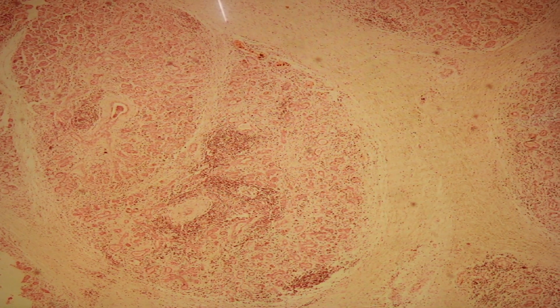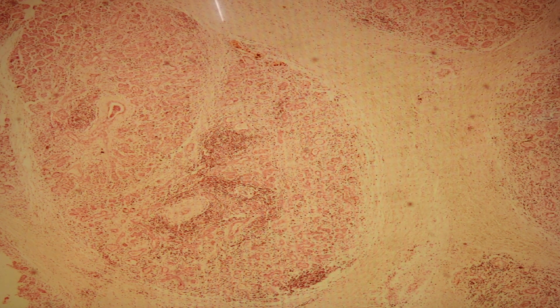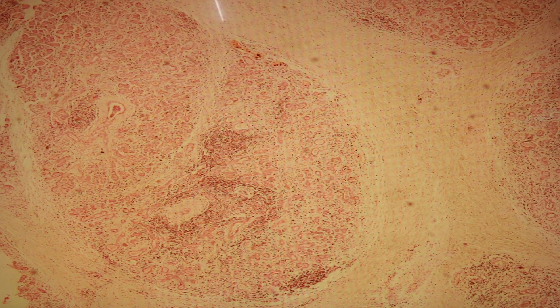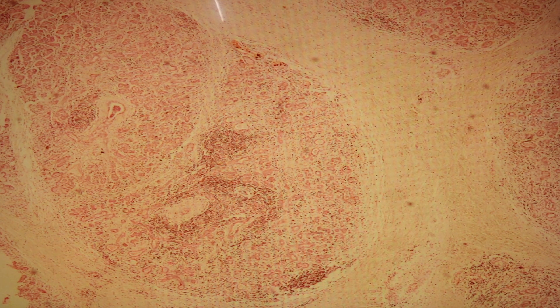Hi class, welcome to the online session. We are going to view the slides for head and neck pathology. We have a total of 6 slides for this session. We are going to start with slide 263.